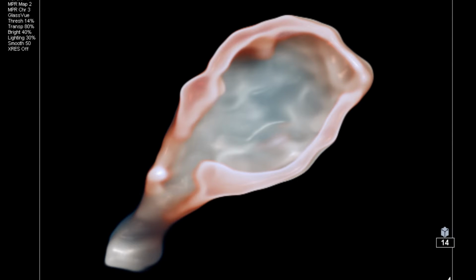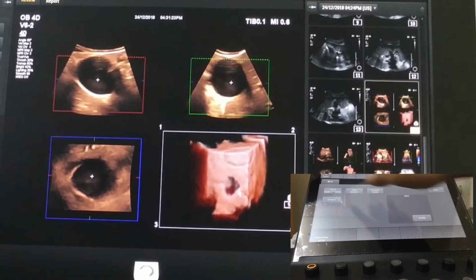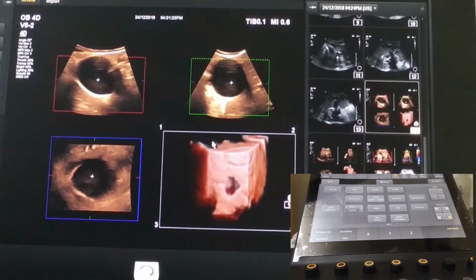This is a 3D view of the gallbladder. Now, a short tutorial about this 3D image processing. The volume acquisition is done by pressing the 3D button over the gallbladder. I am targeting the upper left picture. I am taking the plus point to the gallbladder lumen by the cursor. You can see that other axes are getting changed.